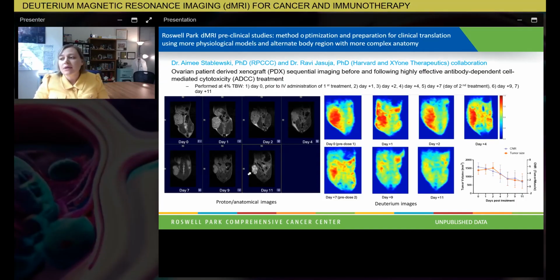And how do you know that? Because if you scan them, let's say 6 months later, you'll actually see that finally the tumor will shrink. And initially we thought, well, how often does that happen? But I'm telling you, it happens pretty frequently. So 1 in 3 patients undergoing cancer therapy will experience something like this.